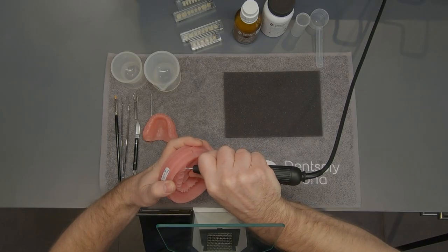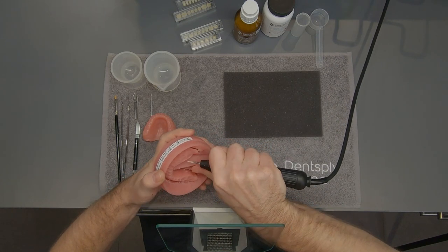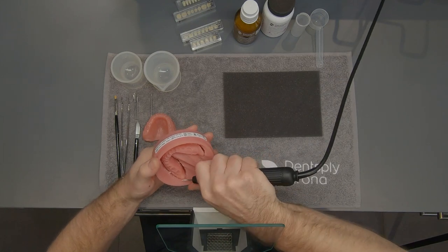Once the milling process has been completed, remove the disc from the milling machine. Separate the denture base from the disc using a carbide burr.